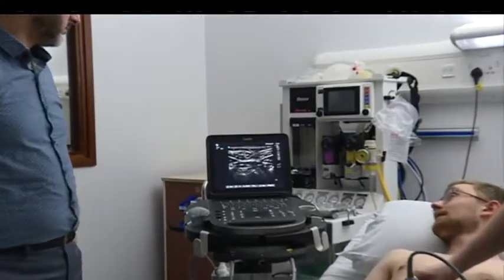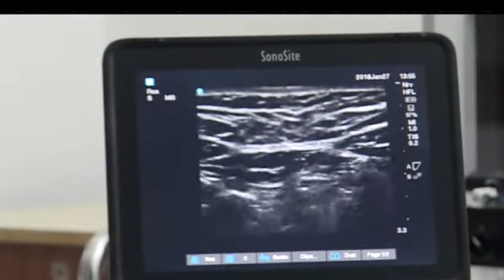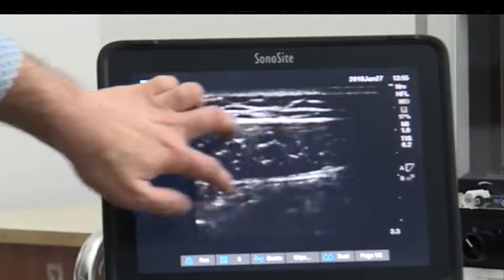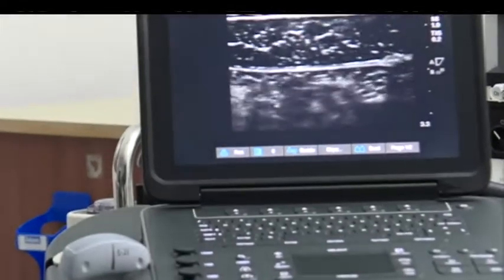So we should see the linea alba there — it's white. On ultrasound it could only be white or black. We've got the linea alba and then whichever way we go we've got a rectus muscle, surrounded by the rectus sheath.